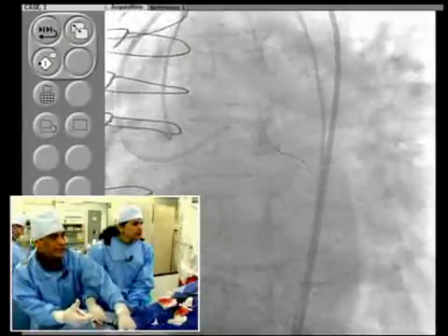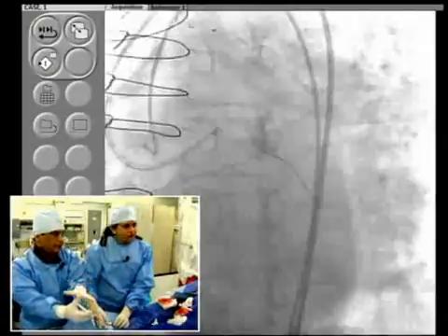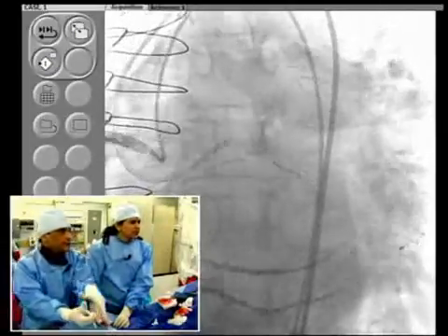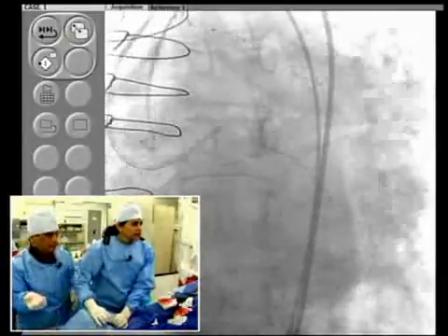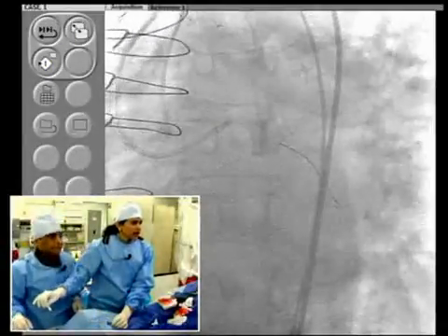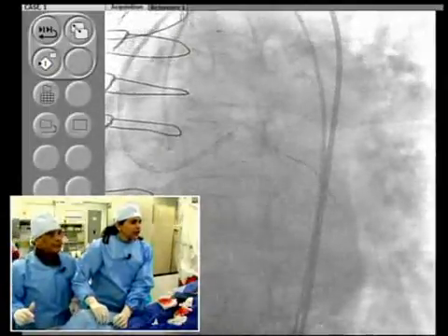Now you can see here the wire has gone. Now we are going to inject. Okay. See? And that's the value of the contralateral. Yeah, but you saw that I had to come all the way proximal and do a re-entry right from the beginning.